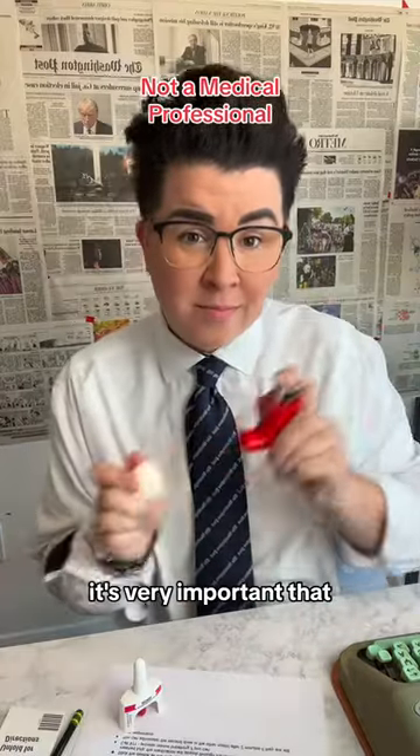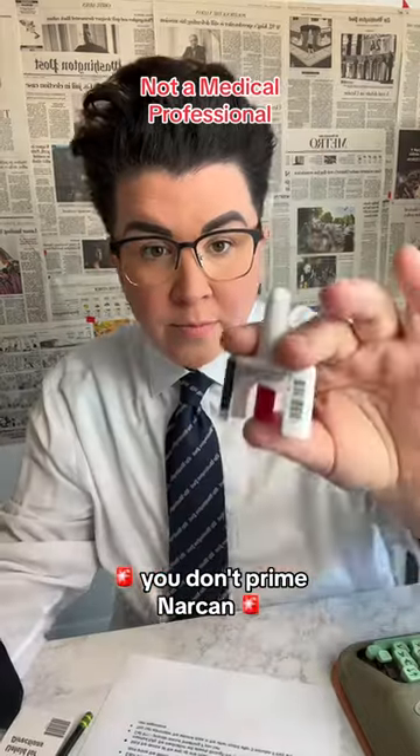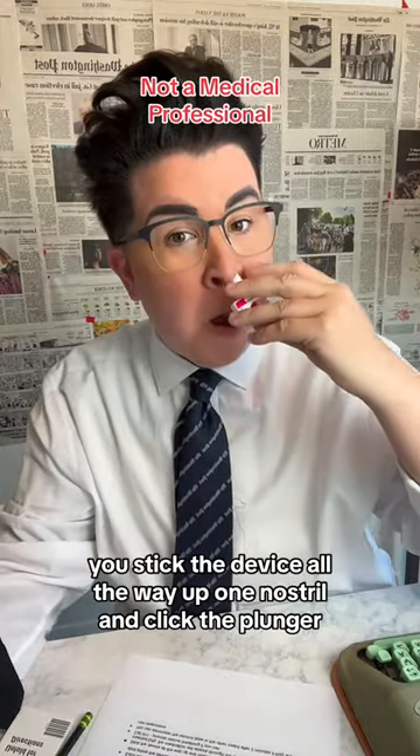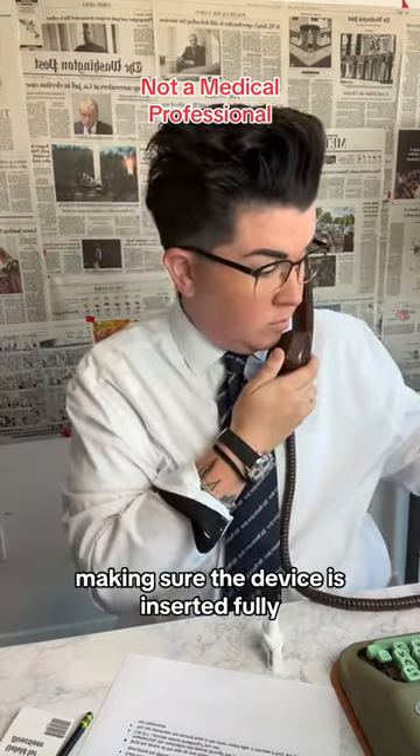It's very important that unlike an inhaler that you have to prime and then inhale, you don't prime Narcan. You stick the device all the way up one nostril and click the plunger, making sure the device is inserted fully.